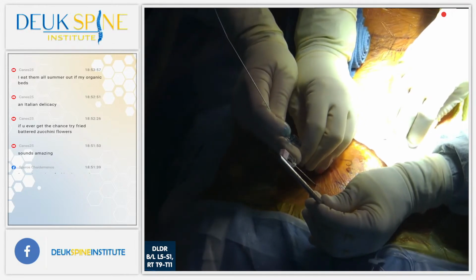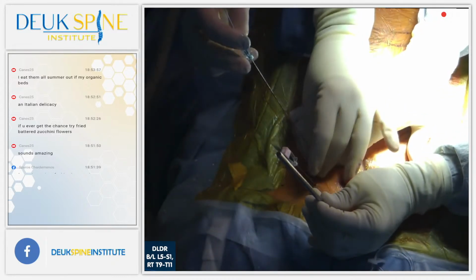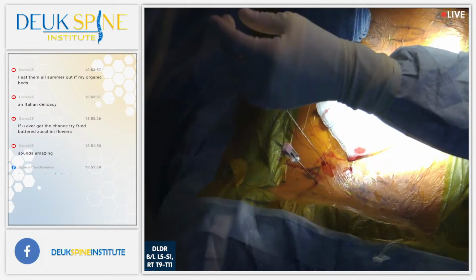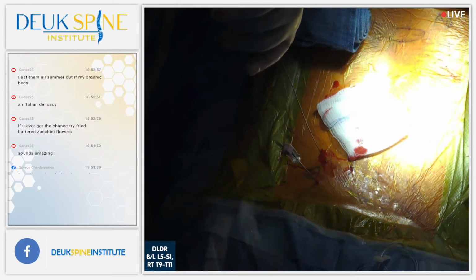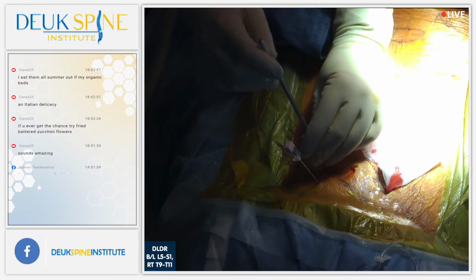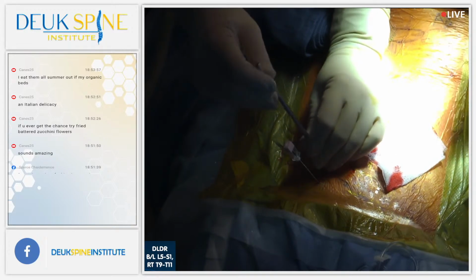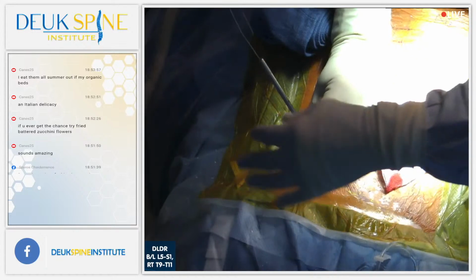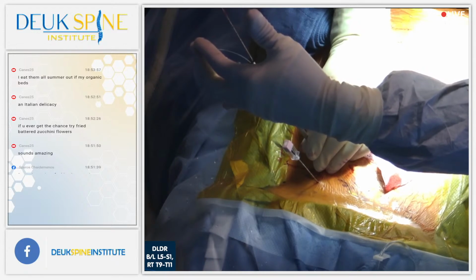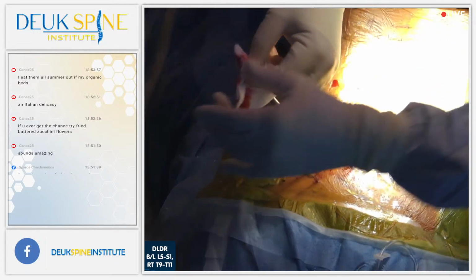Whew, that's tight. Because his discs in the thoracic, especially the lower thoracic, like where they are, these are T9-10, 10-11, they're almost as big as the lumbar. So using a small scope will be really bad. You won't get the job done. That's why I choose the bigger scope for the thoracic for him. Now, if we were higher up, around 3, 4, 5, 6, maybe I wouldn't use the same scope. It's a little bit too much dye on there.